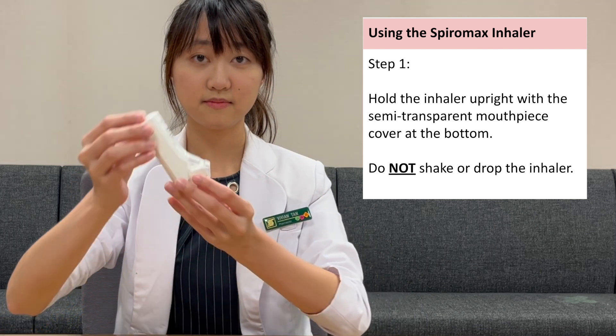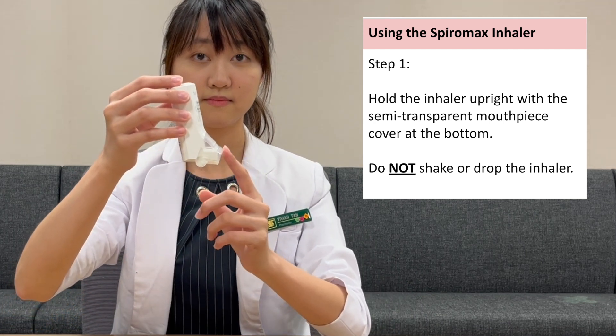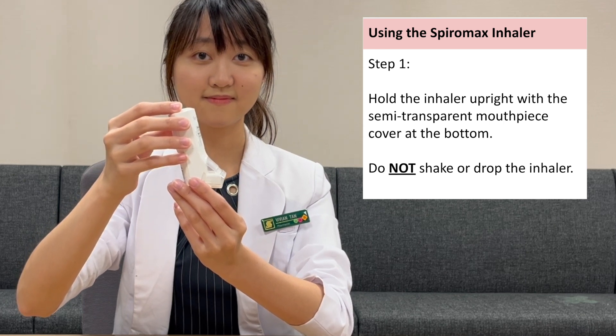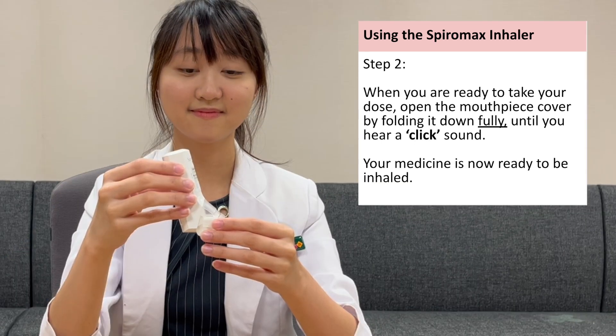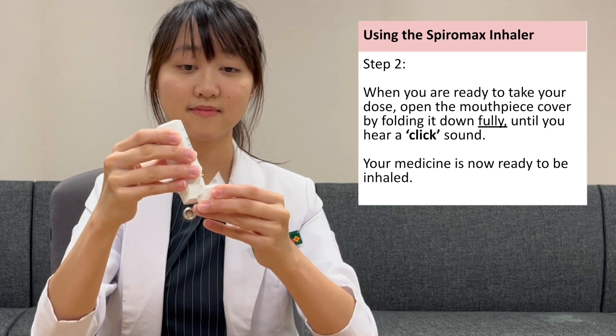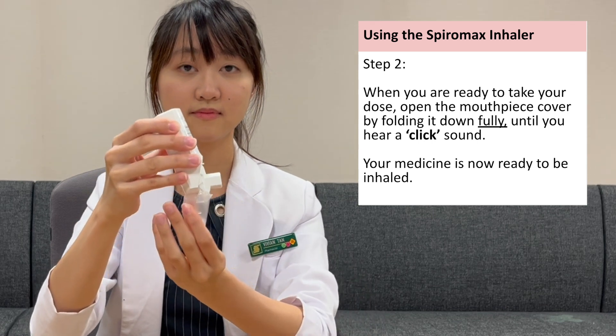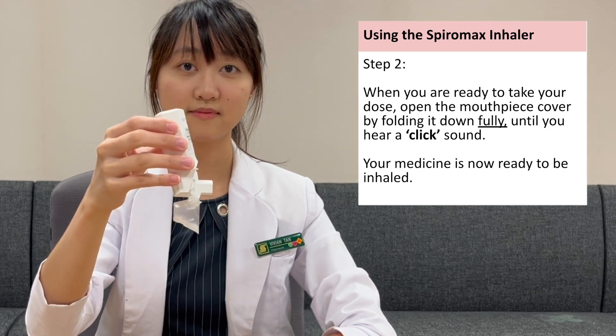Hold the inhaler upright with the semi-transparent mouthpiece cover at the bottom. Do not shake or drop the inhaler. When you are ready to take your dose, open the mouthpiece cover by folding it down fully until you hear a click sound. Your medicine is now ready to be used.